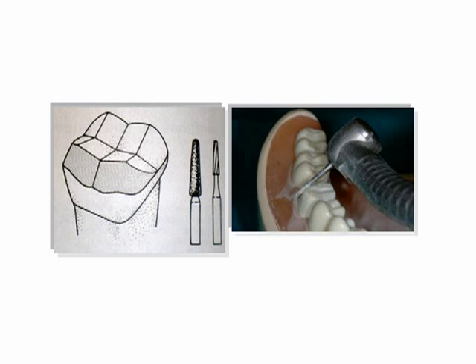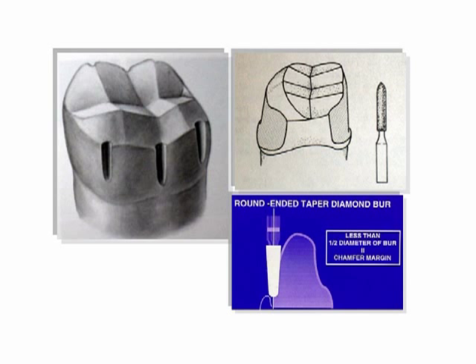Step 3. Depth cuts are placed on the buccal and lingual. Axial reduction is performed in the long axis of the tooth. The chamfer width should be no greater than 1/2 the width of the instrument used to create it. Chamfer depth at the margin should be 0.5 to 0.7 mm. Ensure that the finish line is not lipped. Lipping occurs when the burr is deeper than 1/2 its width.